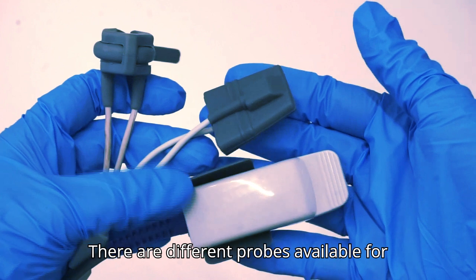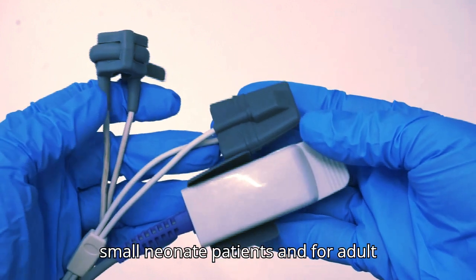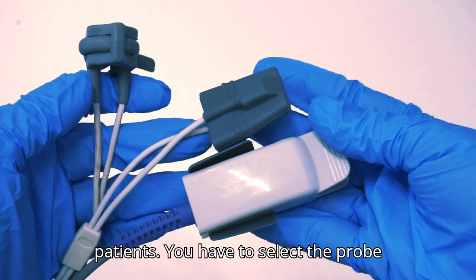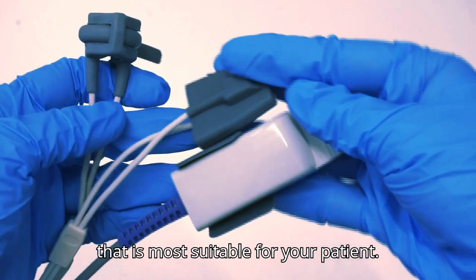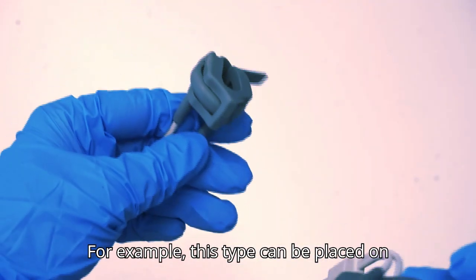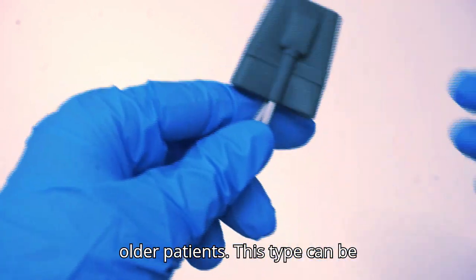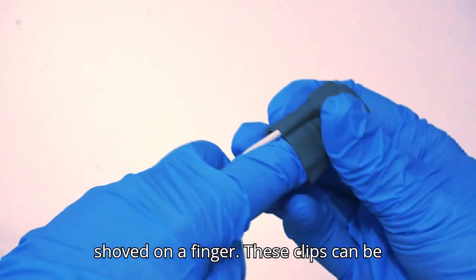There are different probes available, for small neonate patients, and for adult patients. You have to select the probe that is most suitable for your patient. For example, this type can be placed on the foot of a neonate and the toe of older patients. This type can be shoved on a finger.